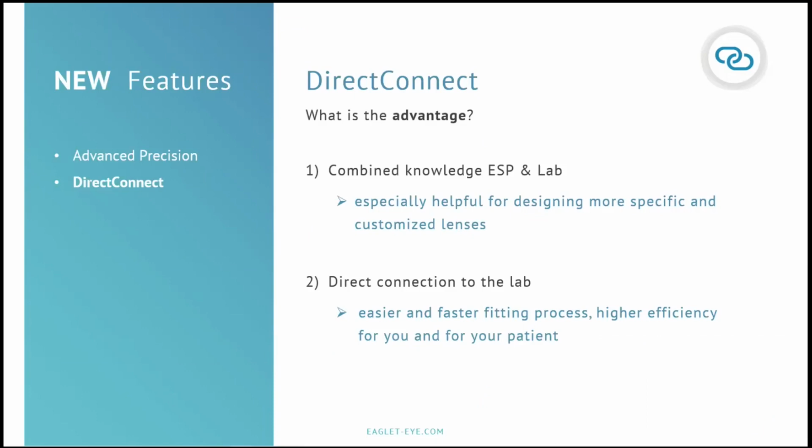So this is really going to help, especially now that it's going more and more in the direction of customized lenses. And also making the process easier for you and for the patient. This is something we all want for any device anyways that we have at home.